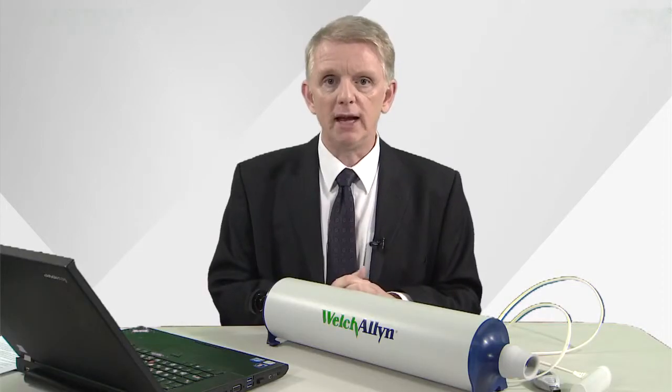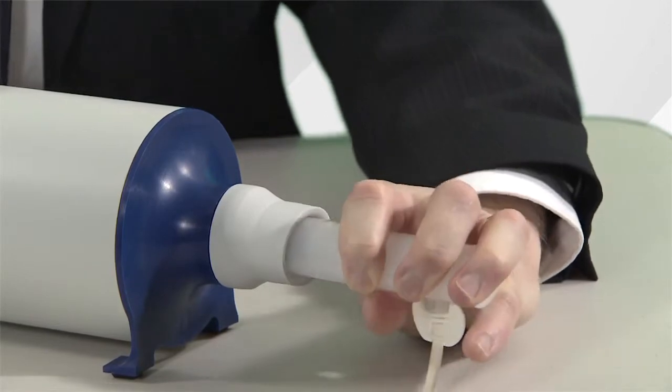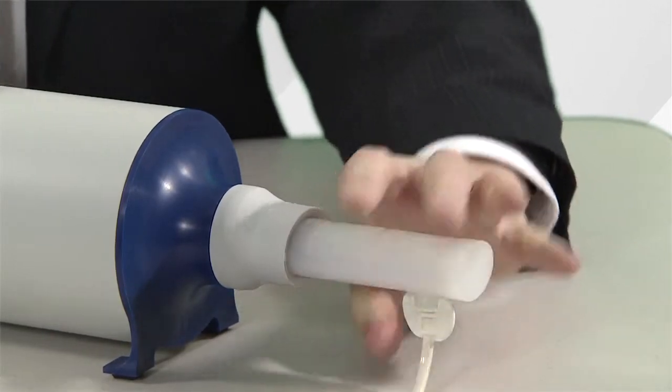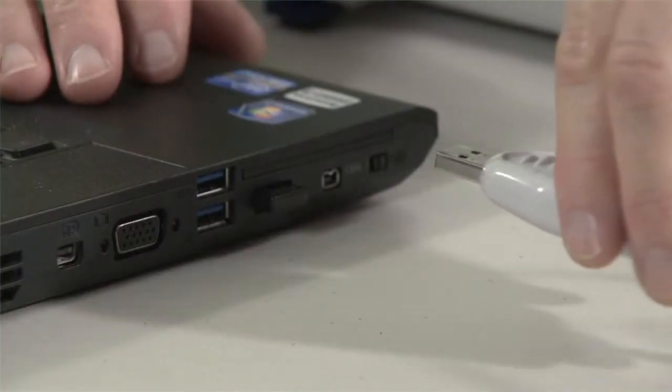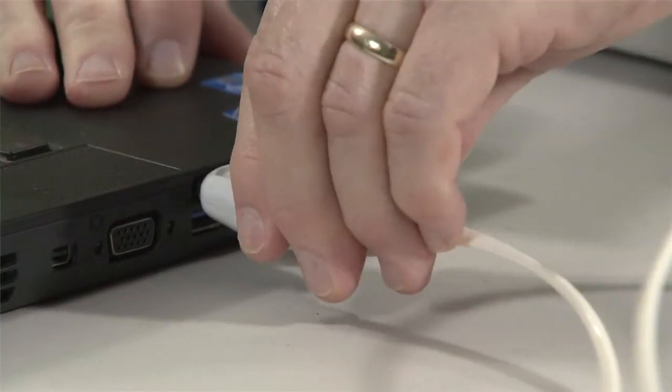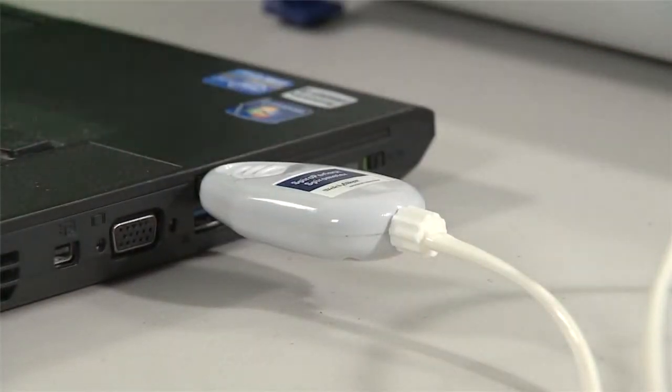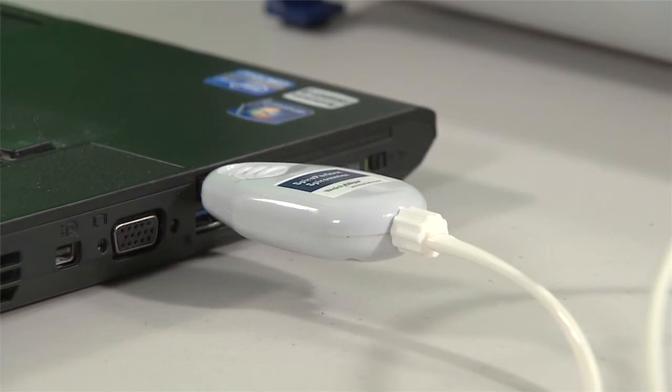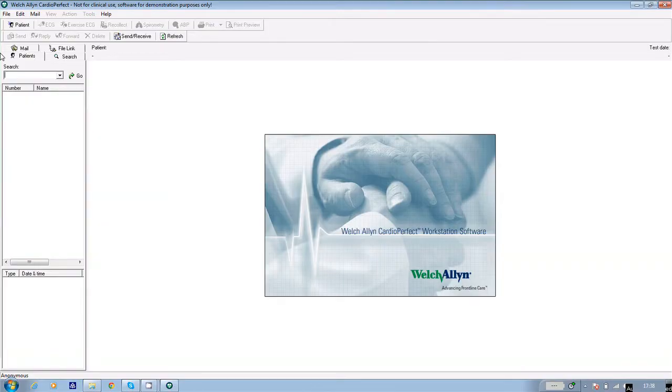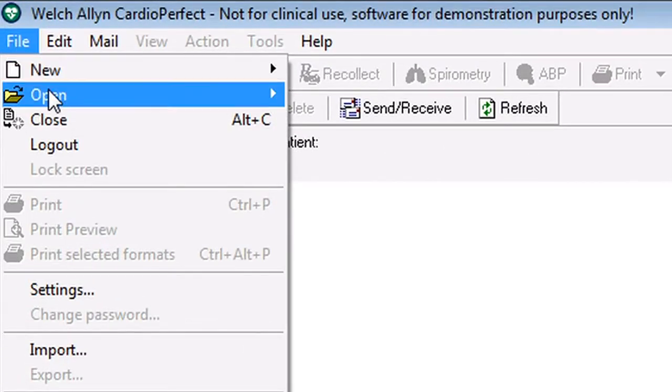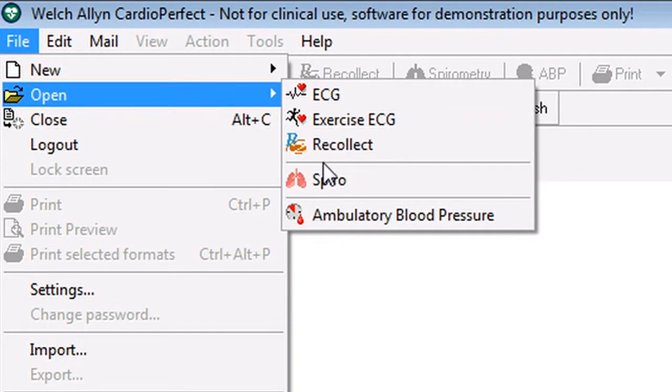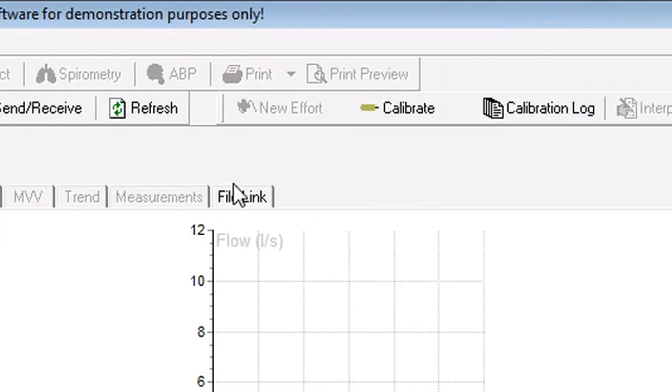And now we're going to move on to calibrating the spirometer. To do this, place a flow sensor into the mouth of the calibration syringe and connect the USB lead to your PC. Then go into the CardioPerfect software. Click on file, open, and spiro. And then click on the calibrate icon at the top of the screen.